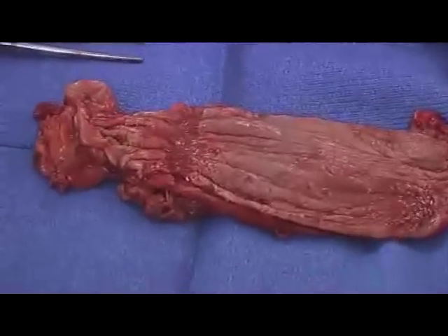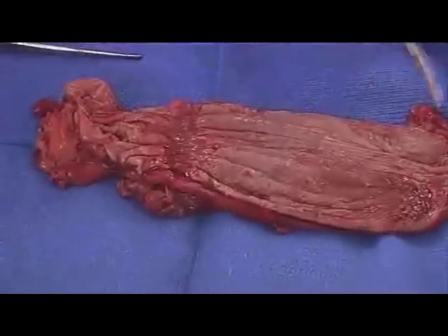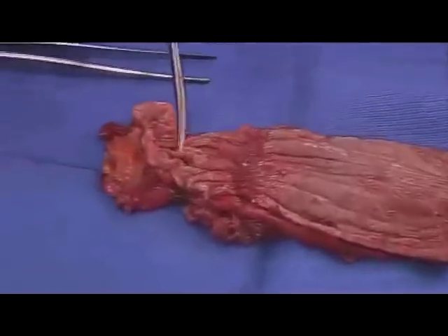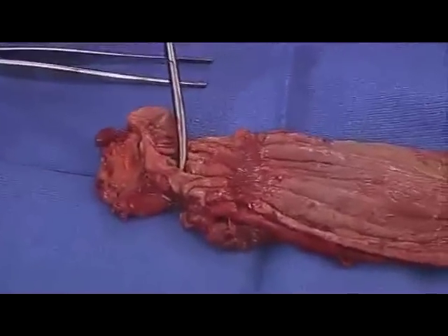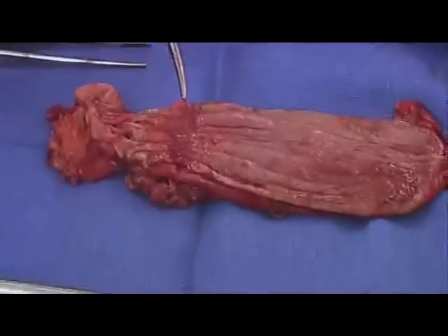The resected specimen has been opened by the pathologist. Its proximal and distal margins, as well as the area of stricturing by the cancer, are indicated.